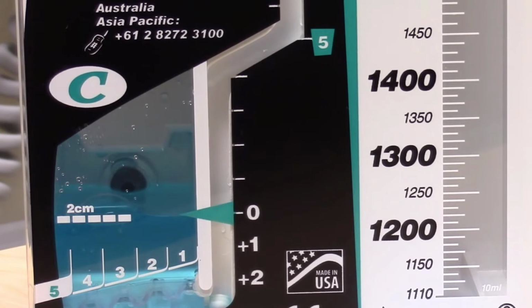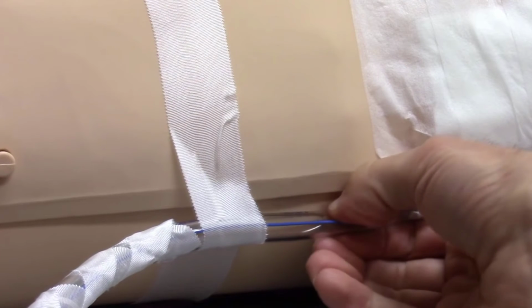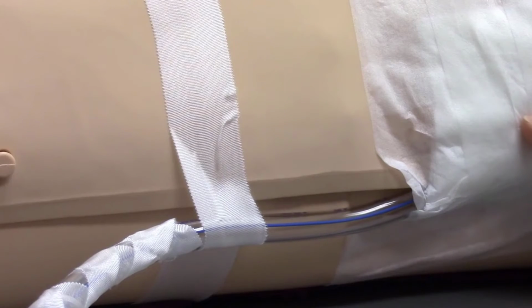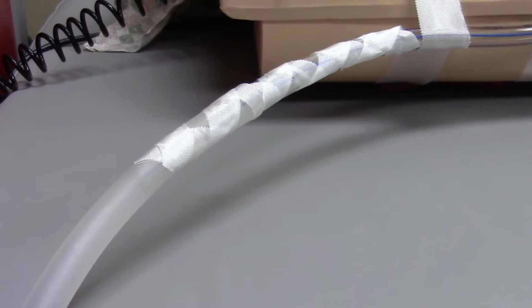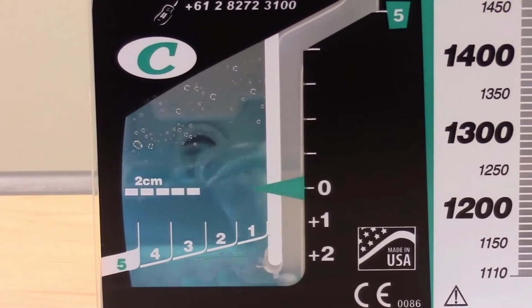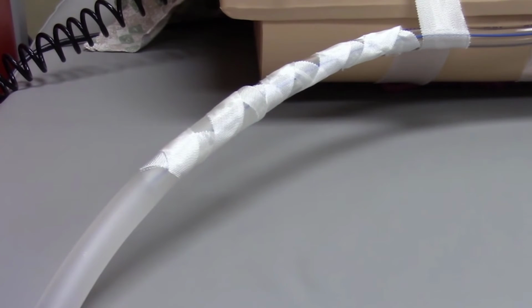If it's a new air leak, you need to identify the source of the air leak and fix it if possible. To locate the air leak, briefly clamp the chest tube at the dressing. If the bubbling stops, you know the air leak is either at the insertion site or in the lung itself. If bubbling continues, briefly clamp the tube just distal to the first tubing connection. If bubbling stops, you know the air leak is in this connection. Try to seal it by reinforcing the connection.